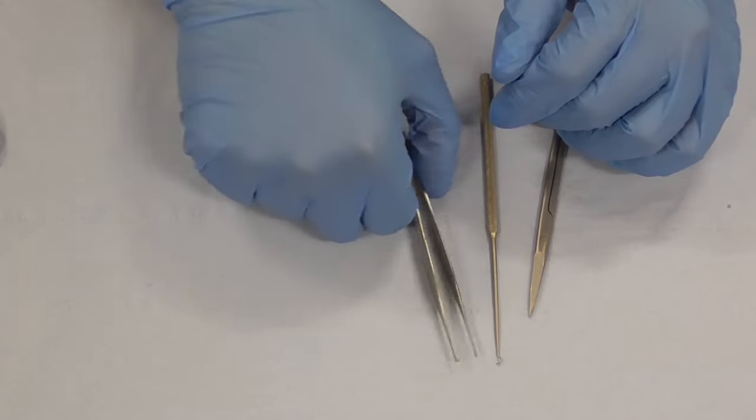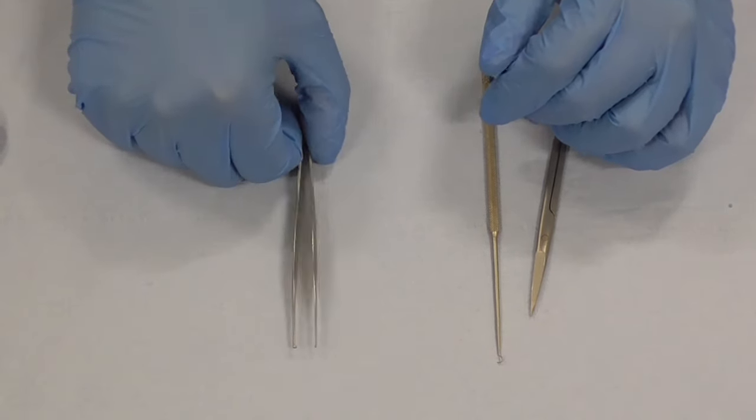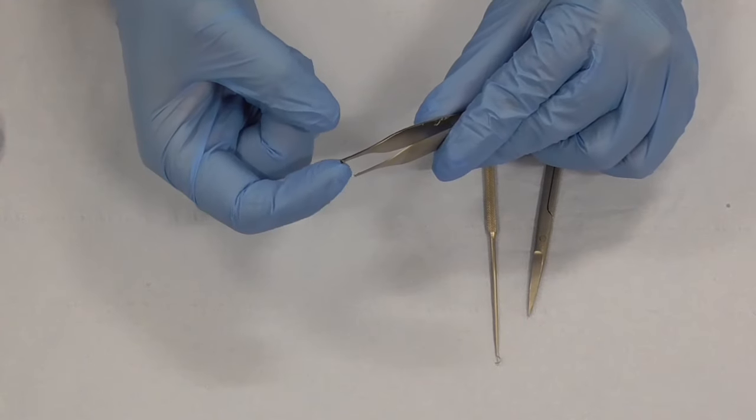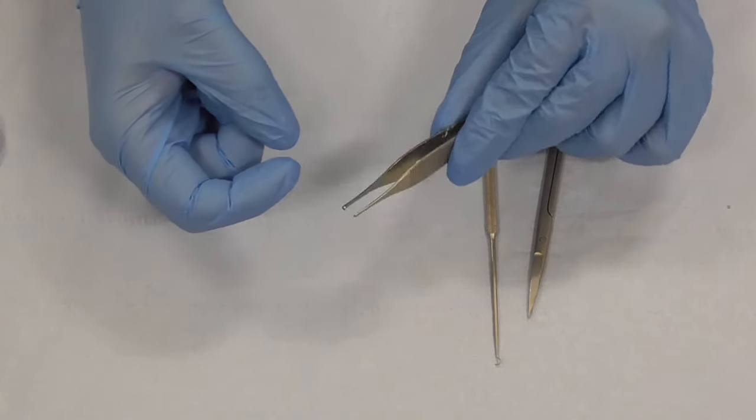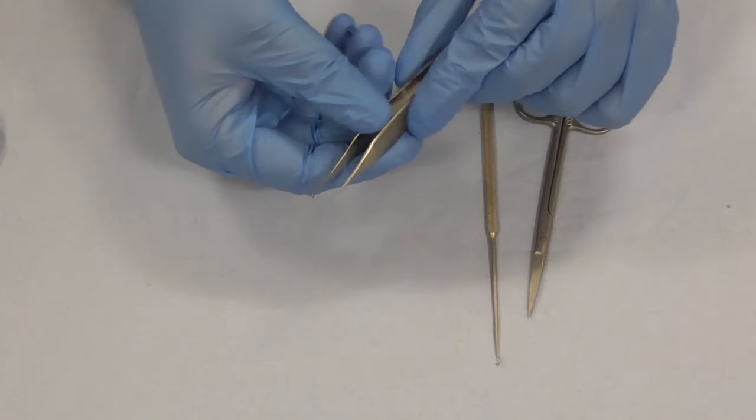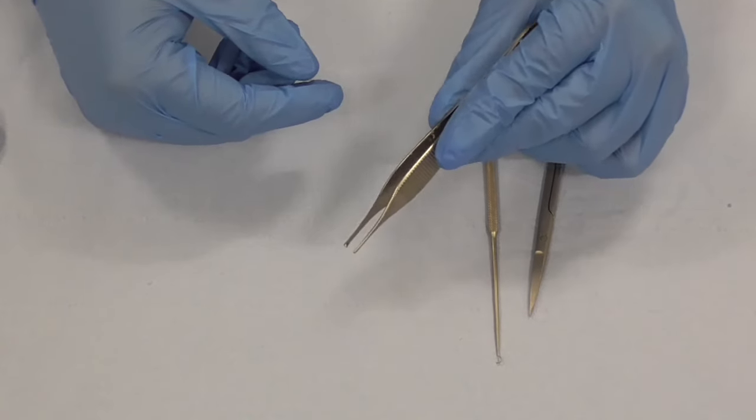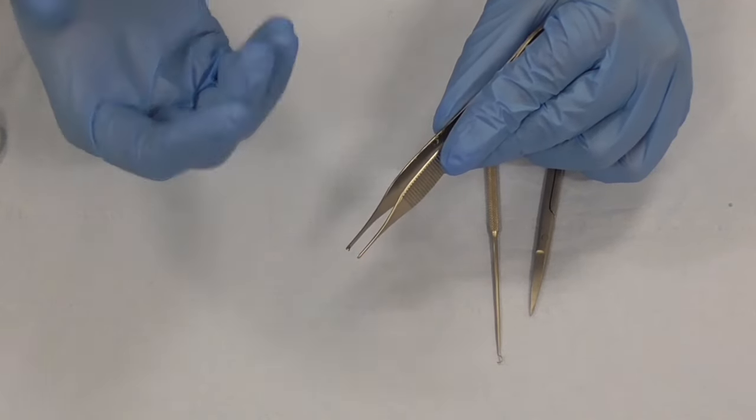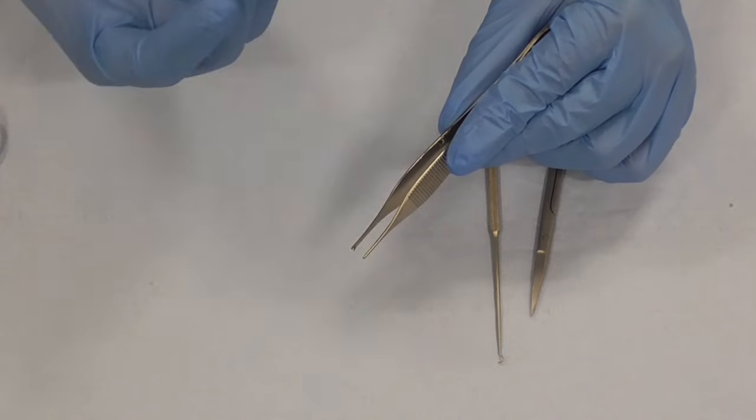The next bit of kit we have is our dissecting forceps and this is a toothed dissecting forceps meaning it's got teeth and the purpose of teeth is to be able to grasp tissue. And whilst that's good you've got to remember that the tissue you're suturing is going to be live tissue and it can be quite friable, it can be vulnerable to injury.